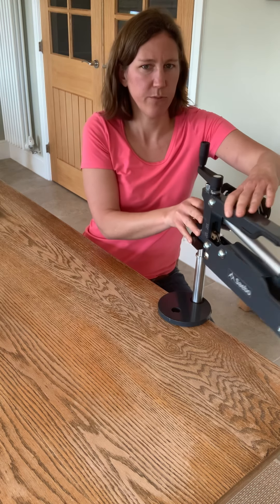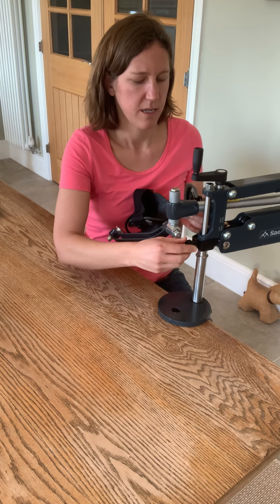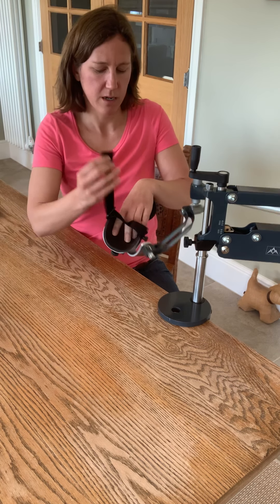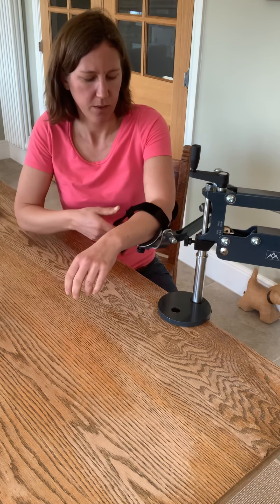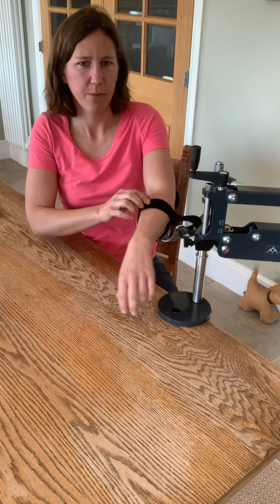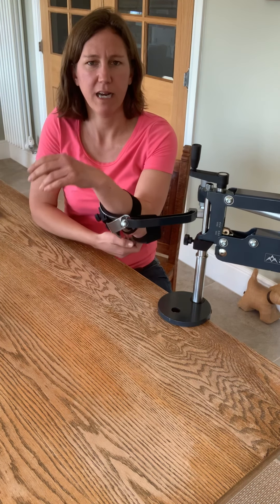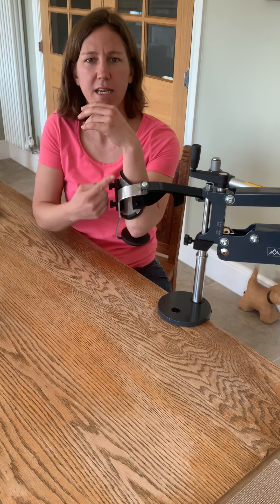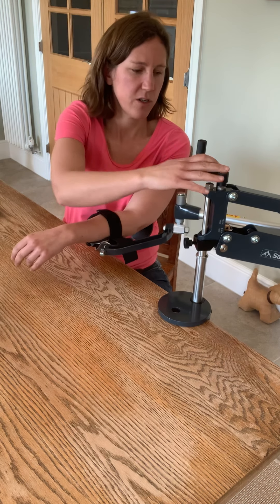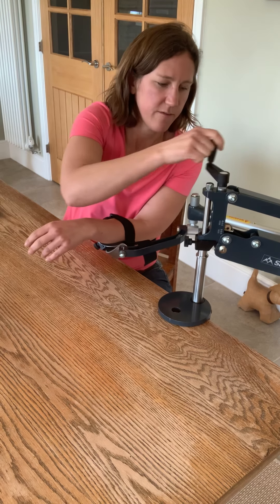I'm going to move it around — I've got it set up for my left arm, so I'm just going to untighten the anti-swivel so it will now move around more freely. I'm going to put my arm into the forearm support, making sure that it's nice and tight. I've also put in the elbow stop underneath so that if I do hand-to-mouth, I won't have any issues with the forearm support sliding. Then I'm going to turn the tension handle just enough so that it takes away the effect of gravity.